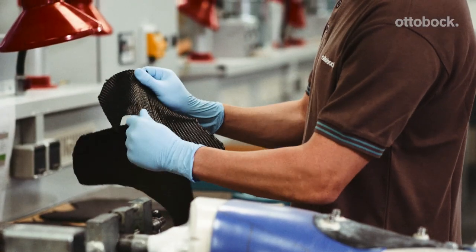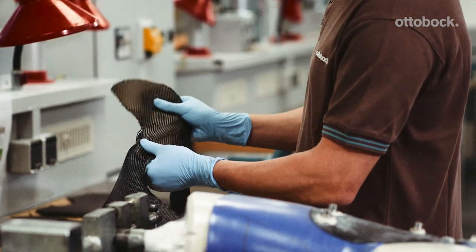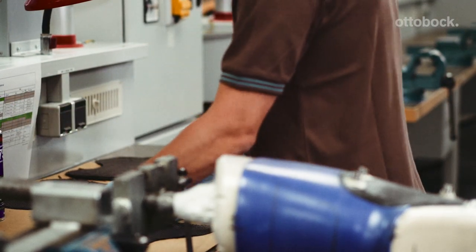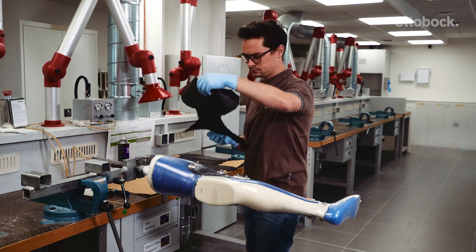Take the Orthopox carbon layer with a 90 degree fiber direction, which has been cut according to the pattern, and stretch it in all directions so that it can be positioned more flexibly on the model. Moisten the layer with spray glue and position it on the model.